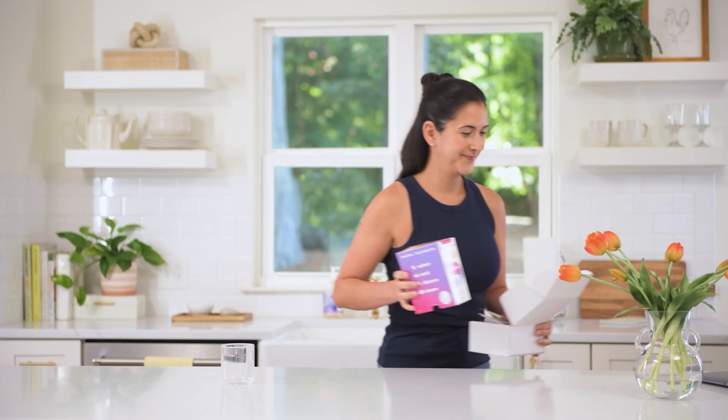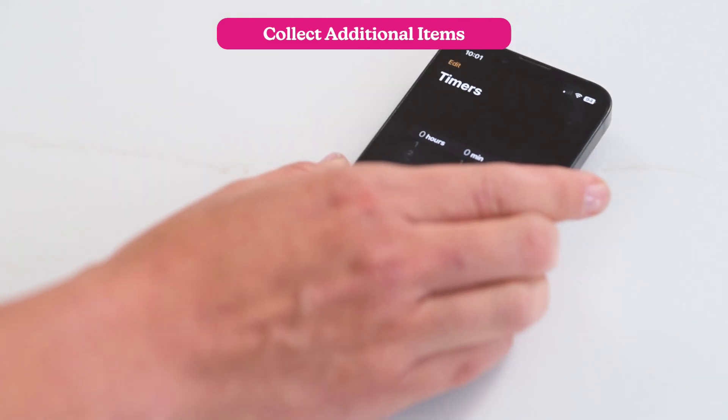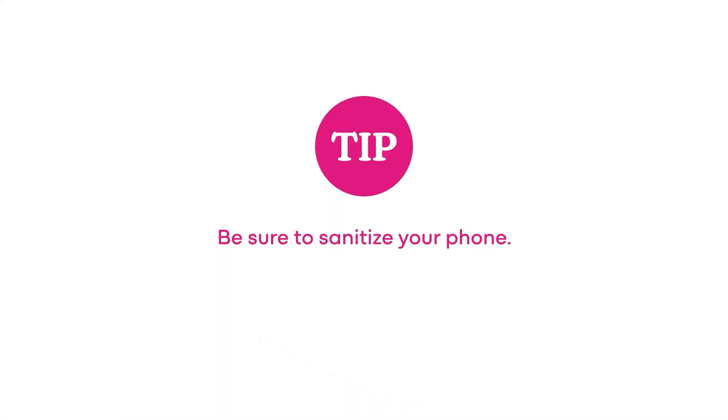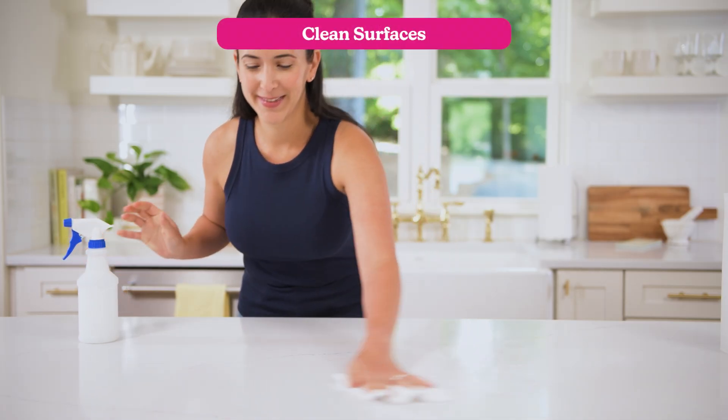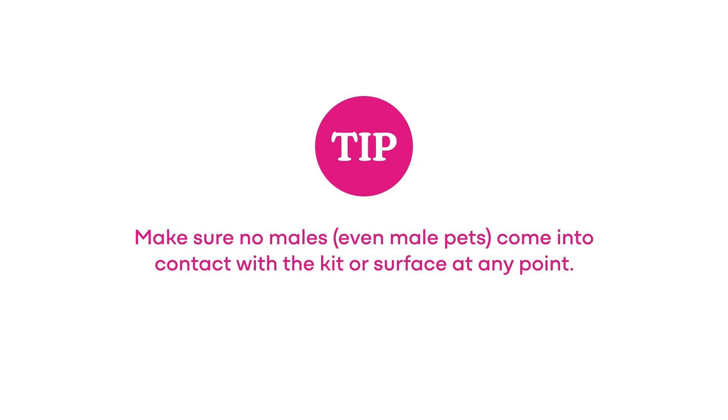Select a flat counter or table to take your test and collect these additional items: paper towels, household cleaner, and a timer. Thoroughly clean your space with household cleaner or warm soapy water. From this point on, make sure there's no contact from males with your test kit or supplies. Even a tiny amount of male DNA could affect your result.